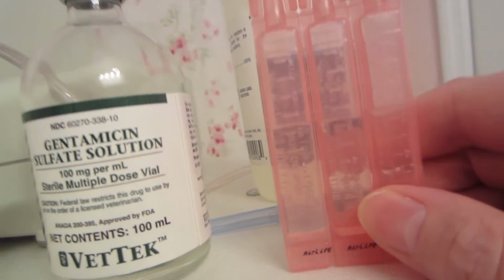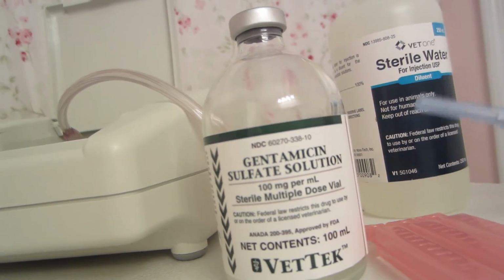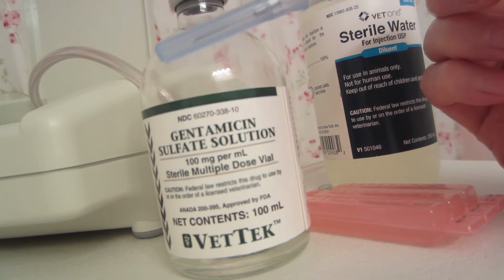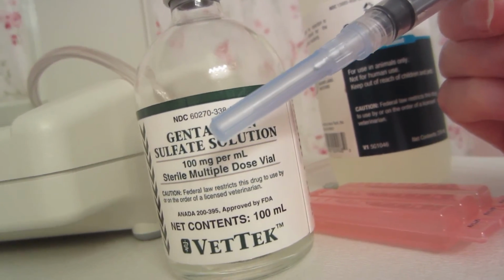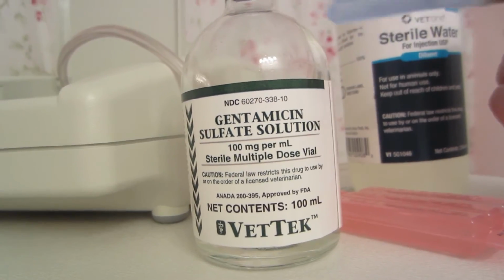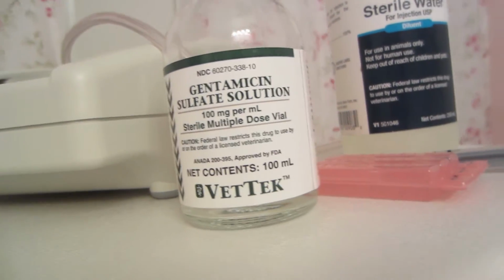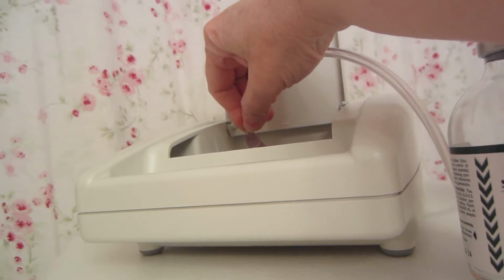I like these. These are little 3 milliliter sizes, and you're going to need a syringe with the needle on it to get your medication out of the bottle if you're using a bottle like this. You can use tablets of other medications, whatever. There's lots of ways to do this. This is just one.